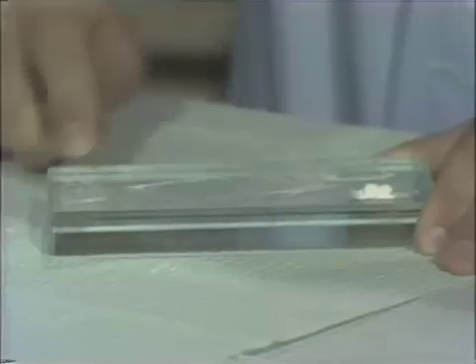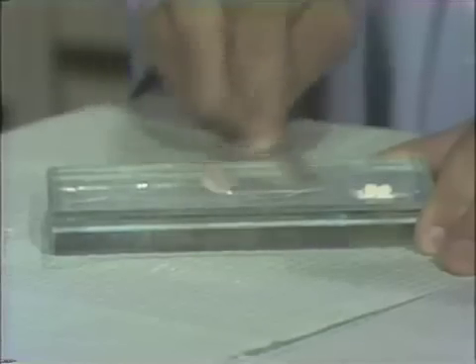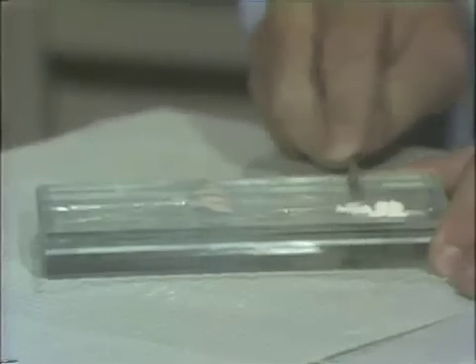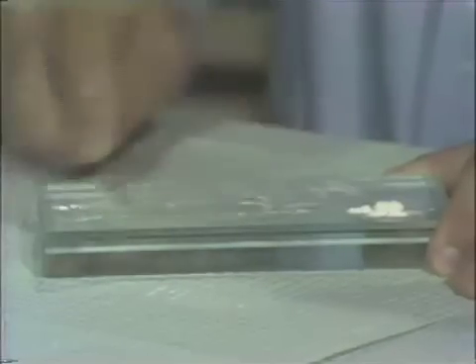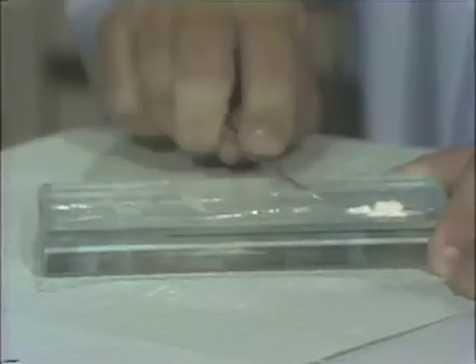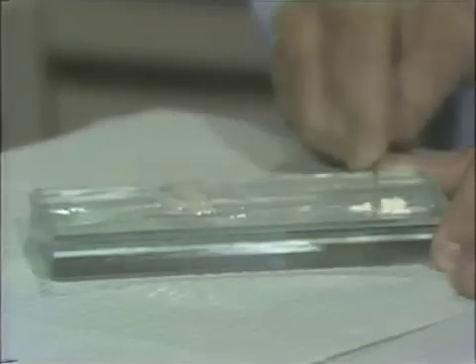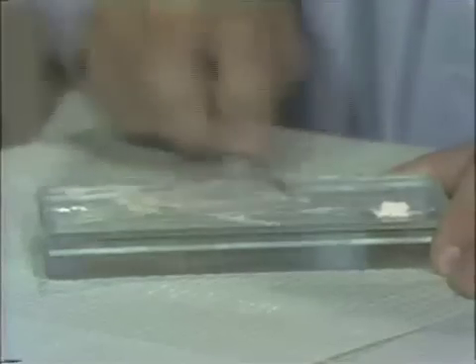Zinc phosphate mixed in the regular way, a primary and a secondary mix. Now we're checking for the primary, not quite ready. So we add a little powder. Remember, when you mix zinc phosphate cement, you are mixing to a consistency, not just the amounts that you put out. Each day it'll vary a little bit. So you mix to a consistency. Should draw up about 1 inch there, or 1.5 inches. A little bit more now will make it just right.